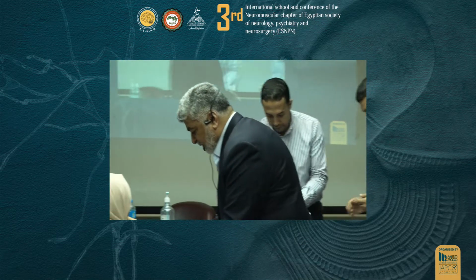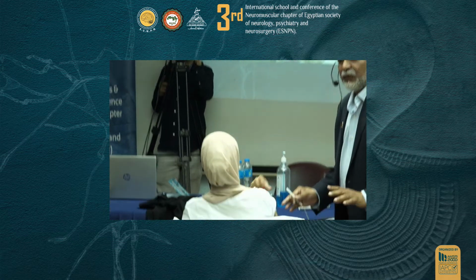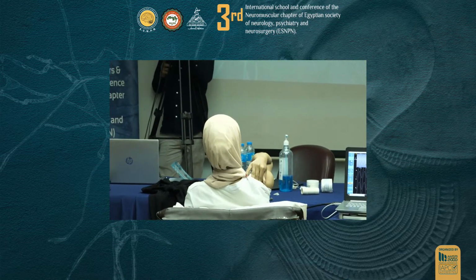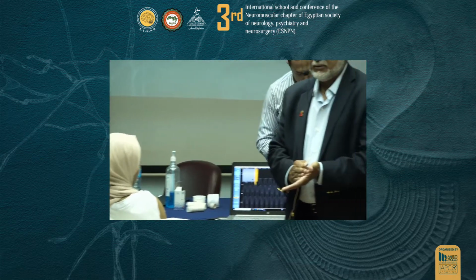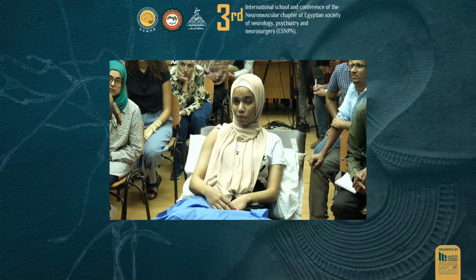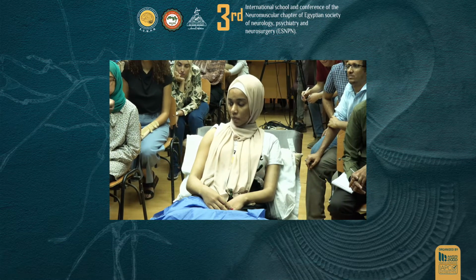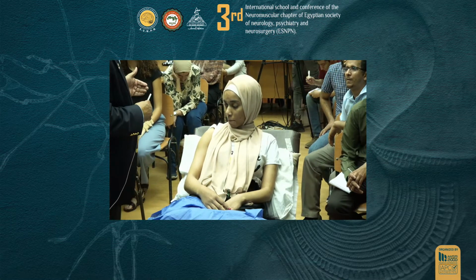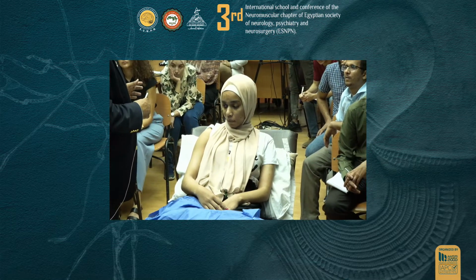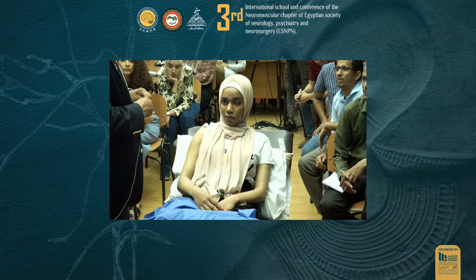So here we go. We'll start with the deltoid. It's a proximal muscle. It's a good muscle to study. It's less painful, okay? Some muscles, with experience, you'll know which are more painful. These muscles are extremely painful. Less painful, but still painful. These are less painful. So we start with the deltoid. Deltoid generally has some complex motor units, about 15 to 20% are complex motor units in multiple phases, okay?